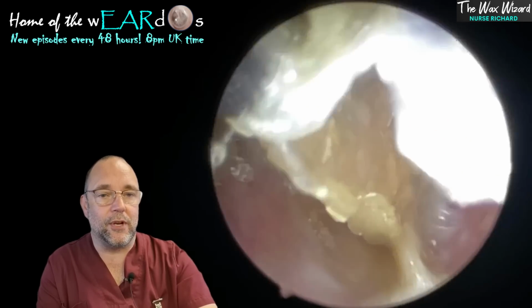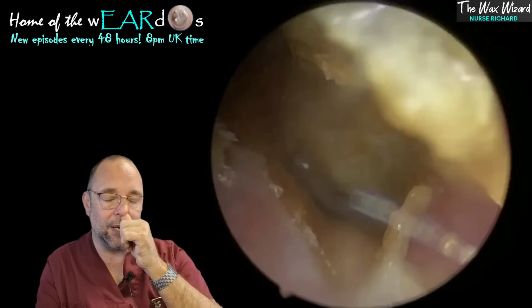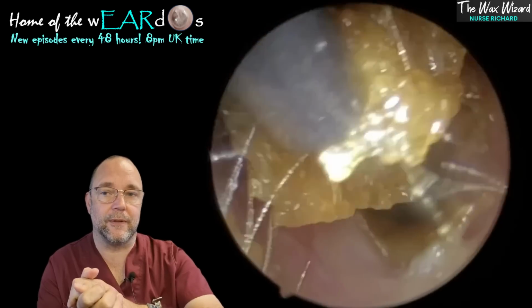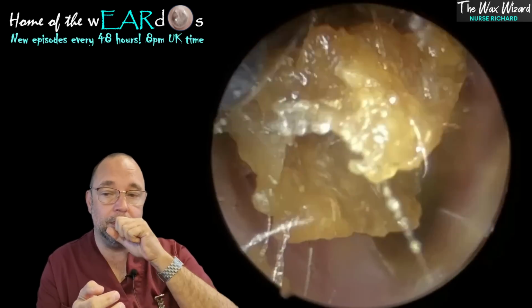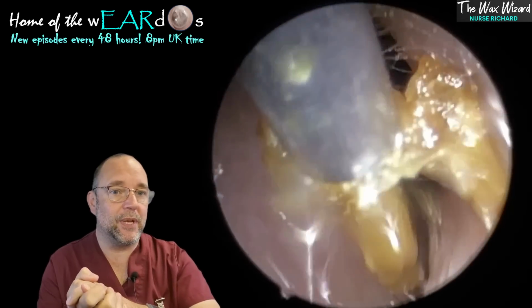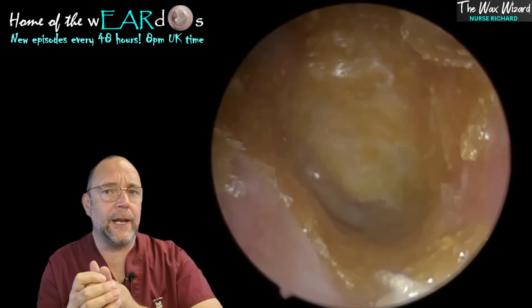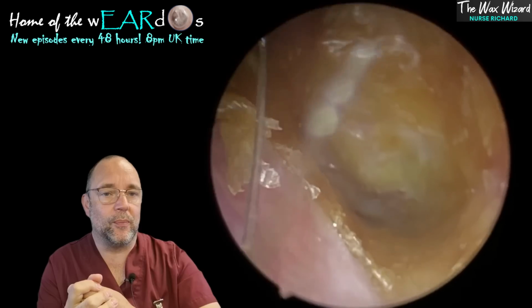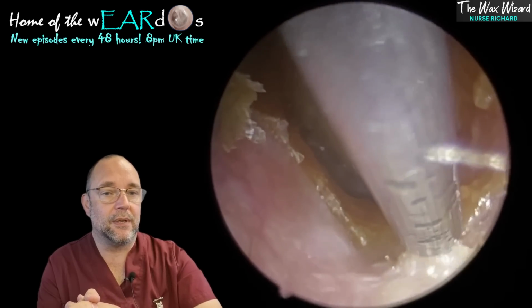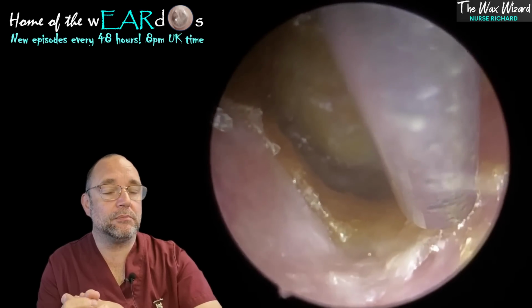Now, I do ask him to oil it before he comes. I don't think he always does, because, as often happens when people put oil in their ears, it makes it feel worse, because the wax in there will absorb the oil, kind of swell up a little bit, make it bigger, and make it feel even more blocked than it already is. So whilst I tell people a couple of days of oil before you come can help, that's not necessarily the case for everybody, because everybody has different consistencies of earwax. Some is quite wet, some is very dry, so for some it can help, for some it can make worse.